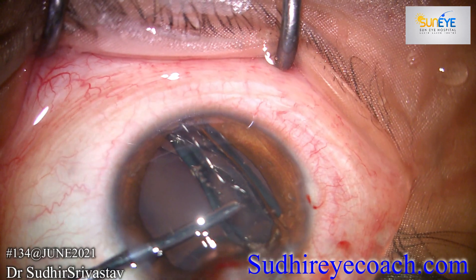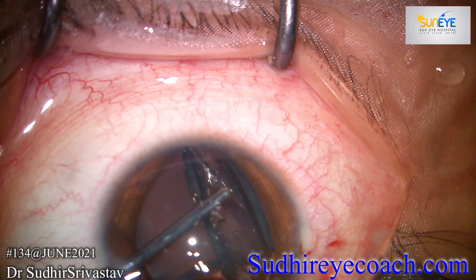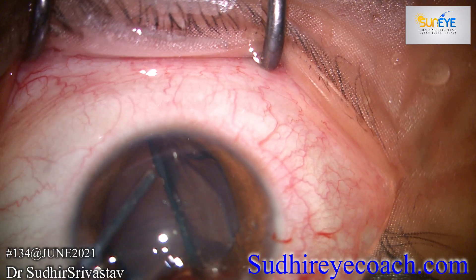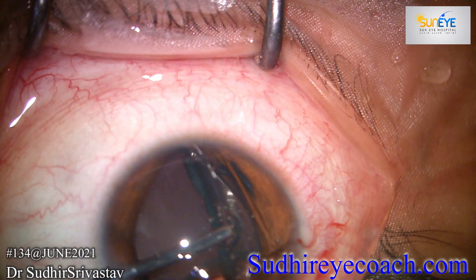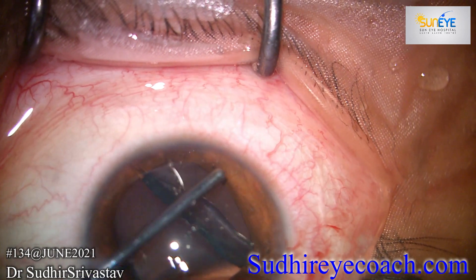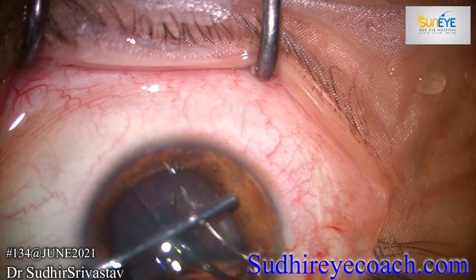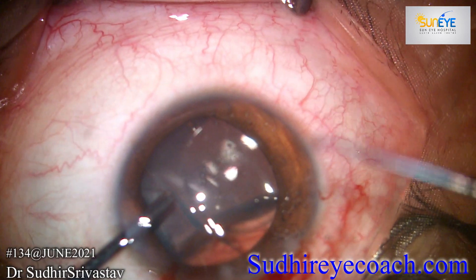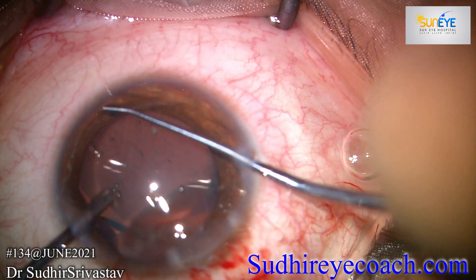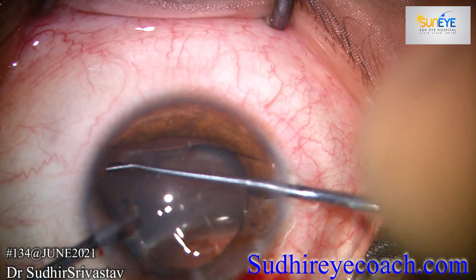Normally the phakic ICL opens inside the eye effortlessly, but here the ICL remained unfolded and I had to do a lot of manipulations to open it in the right way. This is the most crucial time of the phakic ICL surgery — we don't want the ICL to open upside down. Finally with effort it opened correctly, and I rotated the lens horizontally and placed it in the sulcus.